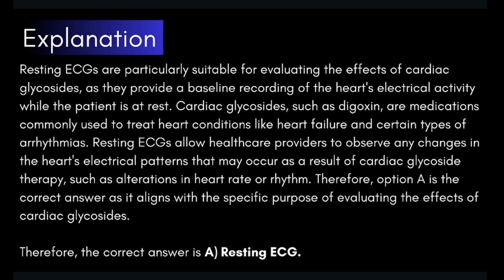Resting ECGs are particularly suitable for evaluating the effects of cardiac glycosides as they provide a baseline recording of the heart's electrical activity while the patient is at rest. Cardiac glycosides, such as digoxin, are medications commonly used to treat heart conditions like heart failure and certain types of arrhythmias.